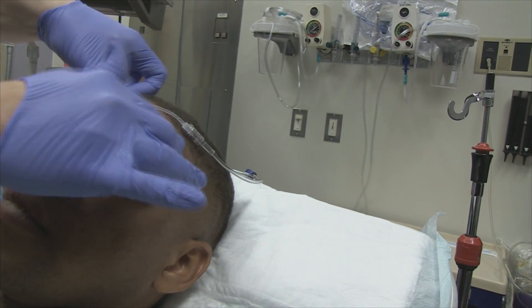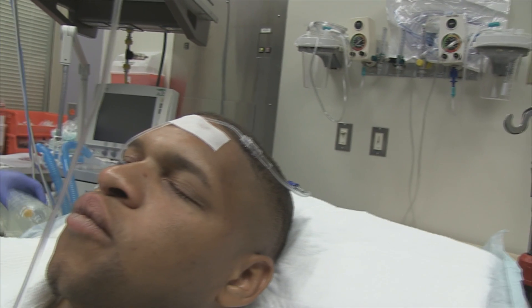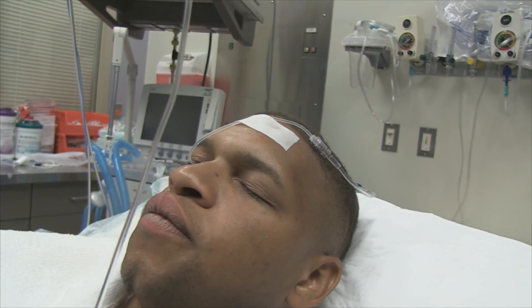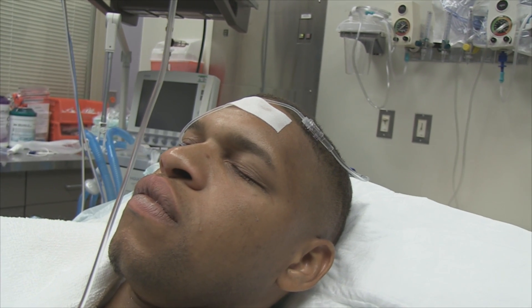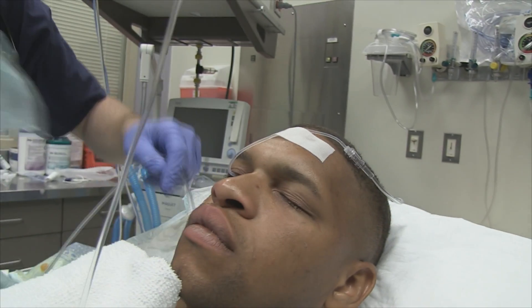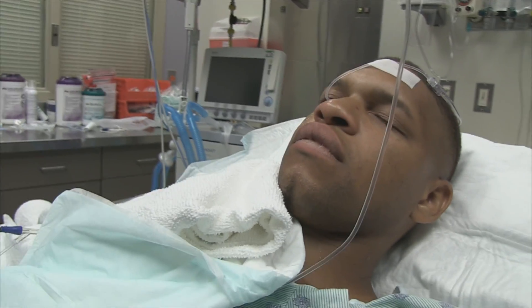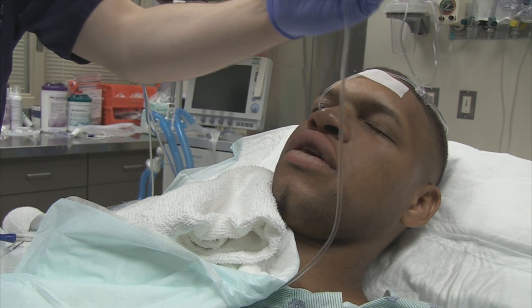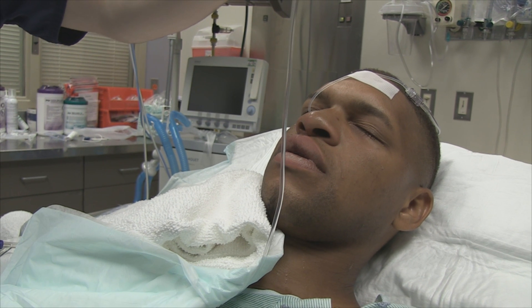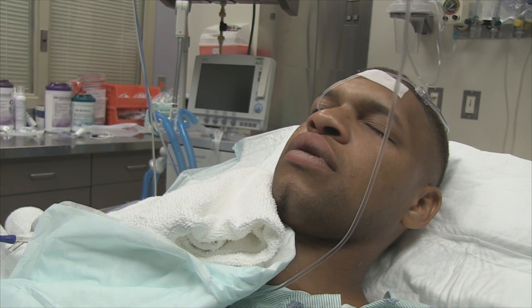We'll tape this to his forehead and put some towels around there to dab the saline as it drips off so he doesn't get soaked. He'll need one on this side too. Is that causing too much discomfort? Not at the moment — great. Let's turn up the rate a little; if it gets uncomfortable just let us know.